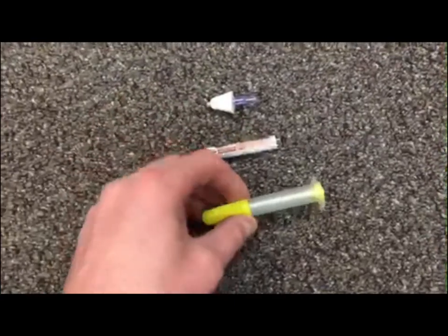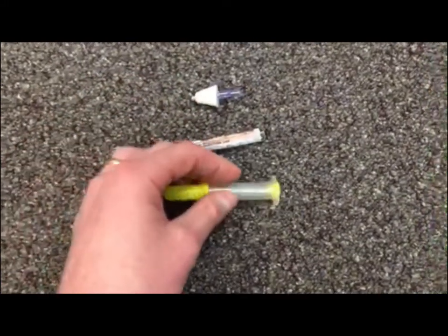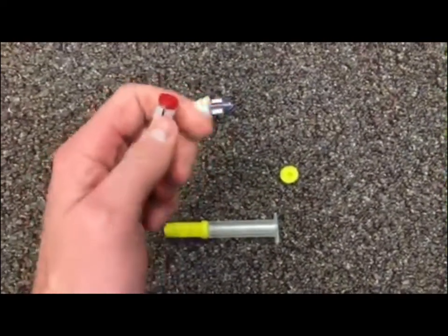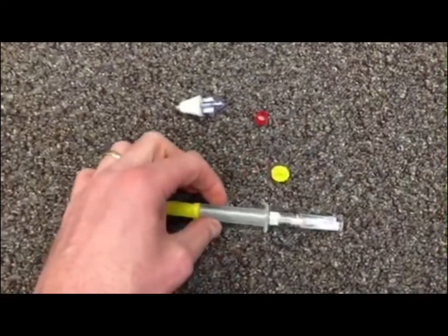The next thing we have here is the device we use to actually inject the medication. You'll see it has a yellow cap on either end. What you're going to do is remove the yellow cap on this side right here. And then you're going to take your medication here, remove this red cap like this, and then this will screw into there and be ready for use.